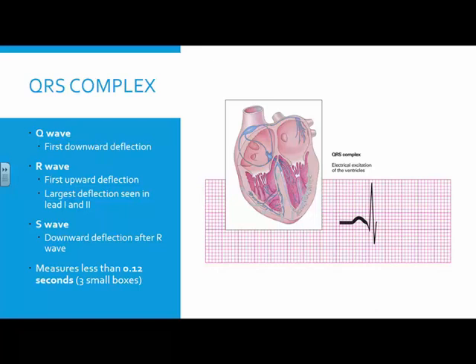Yeah, that's the first downward, till we get back flat. Don't worry about time and stuff. Go ahead and write it down so that you will have it in your mind when we reference it in just a little bit. But we're going to go through the rules of what we need to do for each wave in order to measure. Okay? Right now, this is just telling you what your waves are.